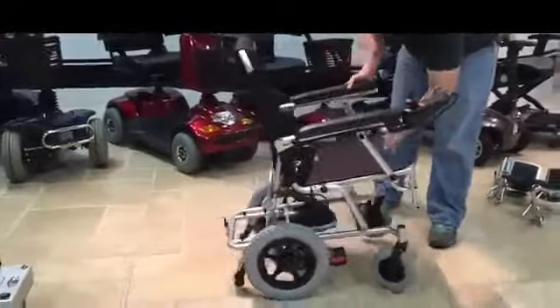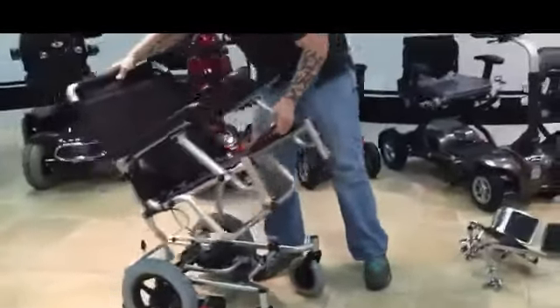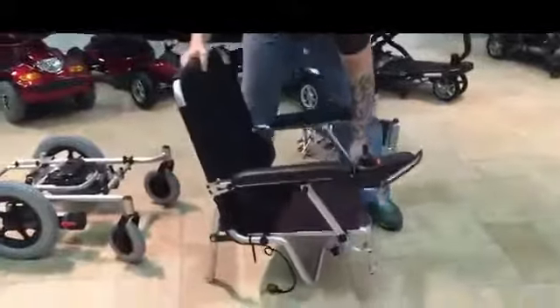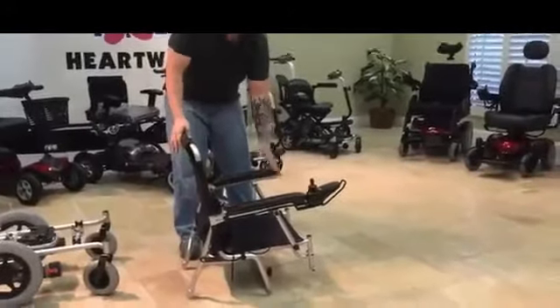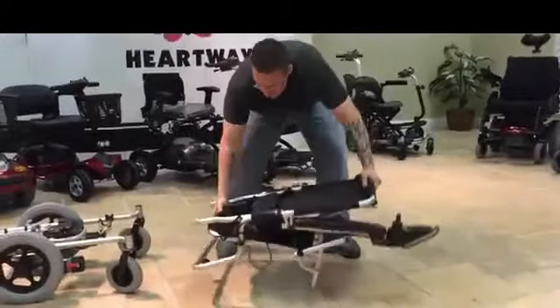Now we'll move to the front. There is a front hinge that we will pull out and disengage the pin. We'll rock it forward and remove it from the base. Okay, now the chair is removed from the base. We'll just fold it forward to fold it up.